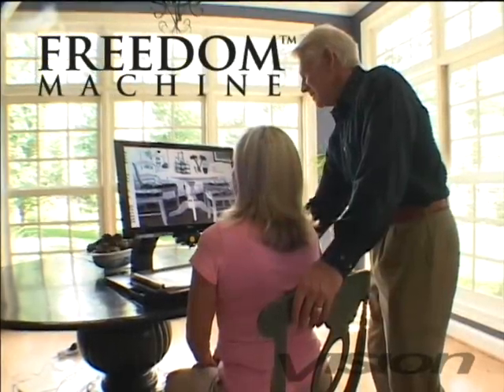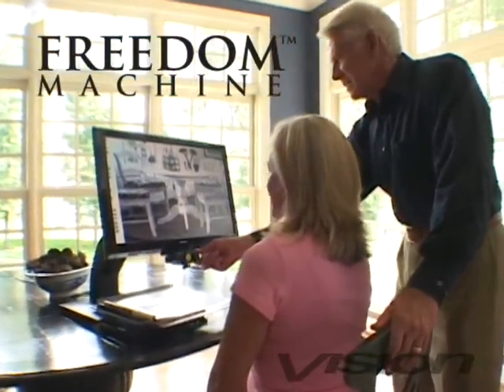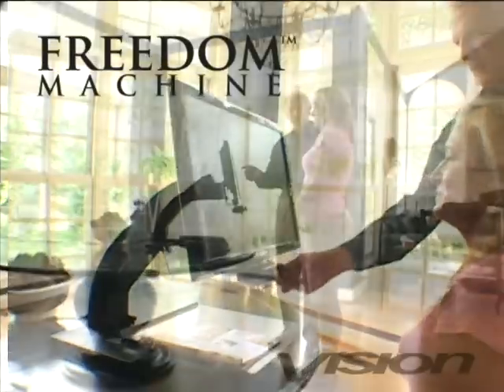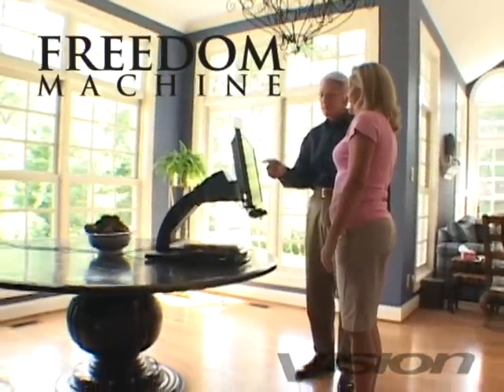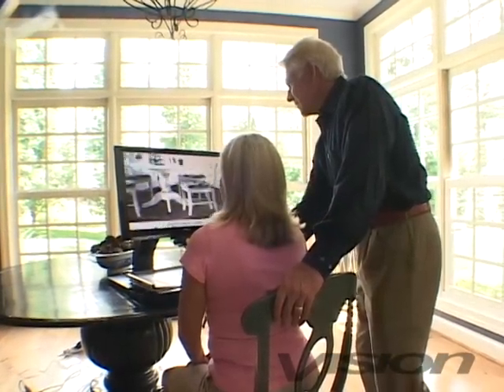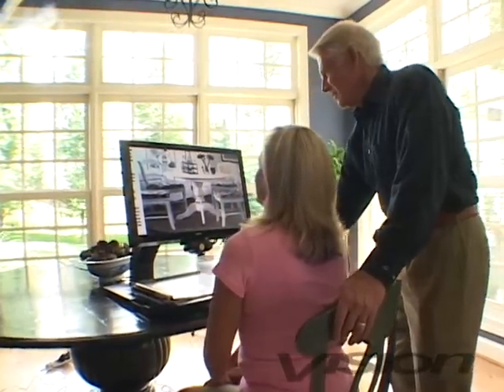Freedom Machine is a powerful and revolutionary magnification device designed to bring back independence to a person with low vision. A result of vision technology engineers, designers and developers working together with low vision specialists and eye care professionals. The main objective in the development of Freedom Machine was to have a high quality product at an affordable price.